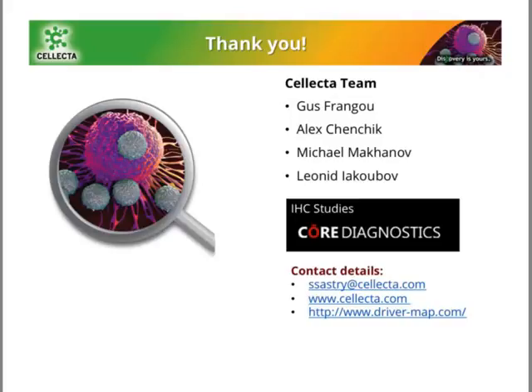So with that, I'm just going to review some of the questions and try to see if we can get the answers. I have a question from one of the attendees saying, can DriverMap determine the abundance or the percentage of immune cells on a single slide? It's a great question. The way we have developed this assay is to look at qualitative determination. For example, if you see a lot of IHC data, it'll say plus or plus plus. That's what it is meant to do at this point.